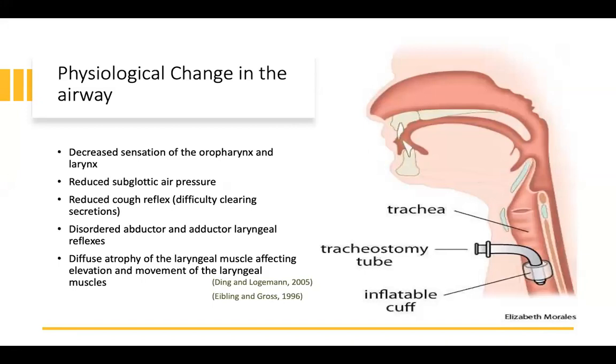The second question was, someone is asking if the trachs need to be changed or we can keep the same one. They do change the trach every 2 weeks for inpatients, but once a patient is, let's say, discharged on a trach, sometimes they change it every month or every 2 months. So yes, it needs to be changed.